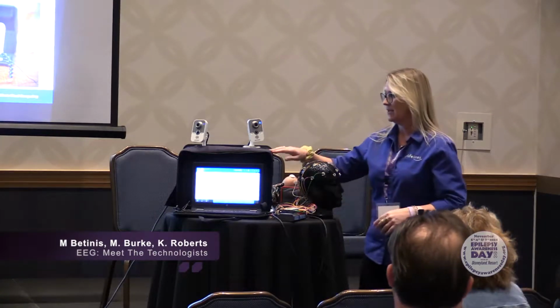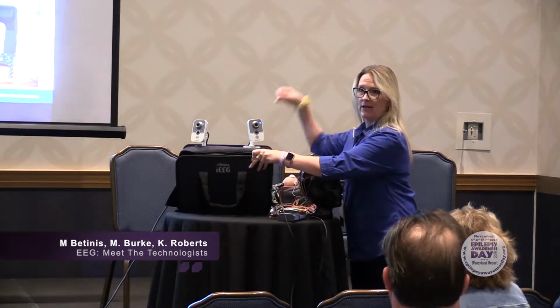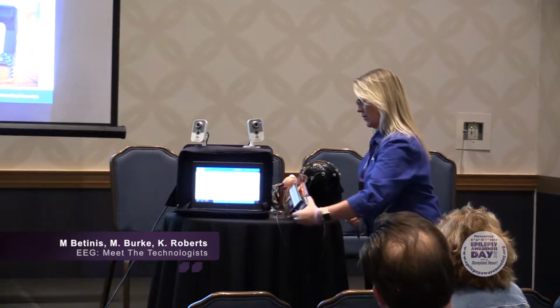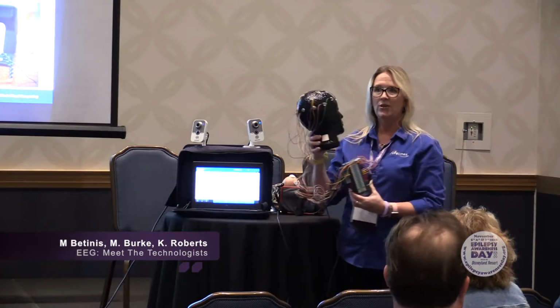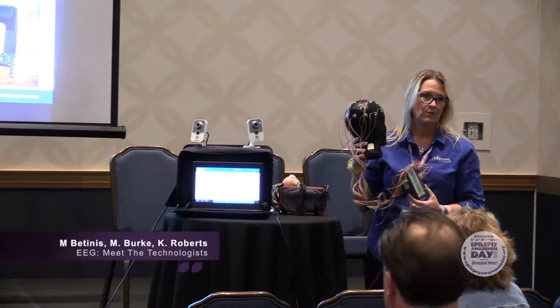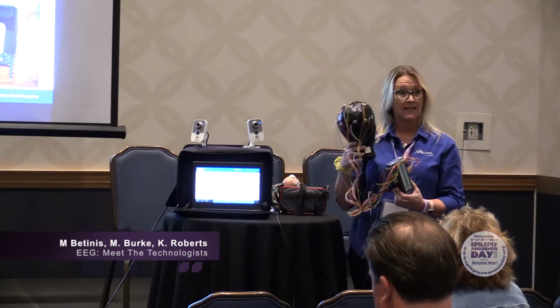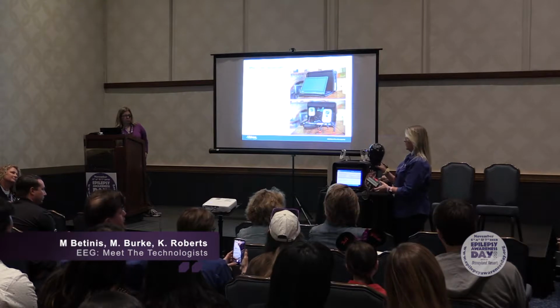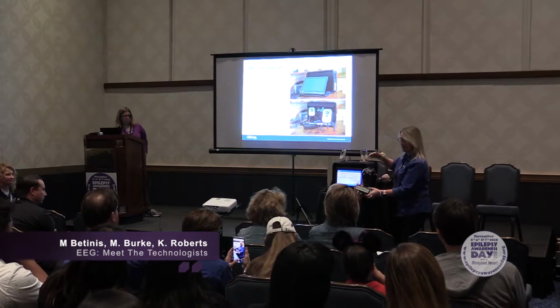For the ambulatory EEG, we send this home with 2 cameras. Basically, it folds up, you carry it home, you open it up, and you're ready to go. You have a little ambulatory recorder here, and this is usually what your head looks like after it's hooked up. And you could actually have the collodion applied for long term, or now, many times they're using other methods, trying to get away from the glue and this kind of stuff. But as long as it stays on, that's the goal. And again, symmetry is of the utmost importance because you have to be recording from the exact spot on the left as you are on the right.